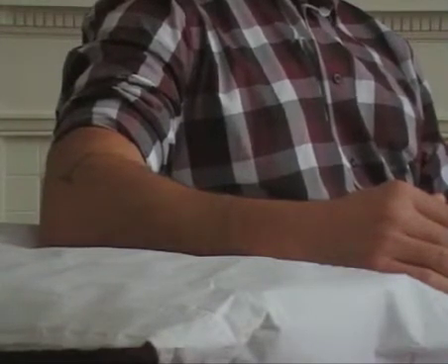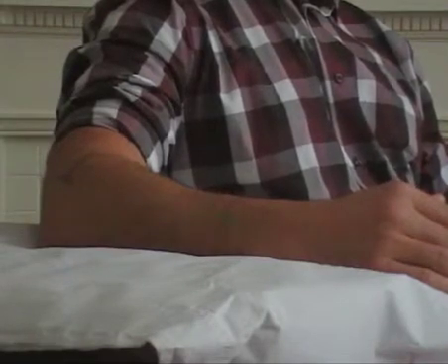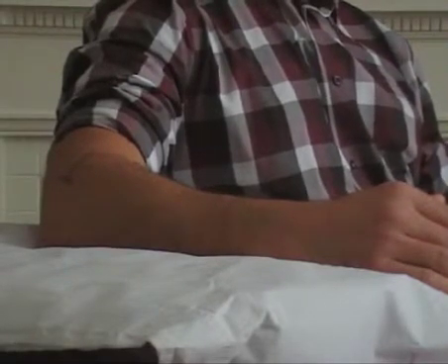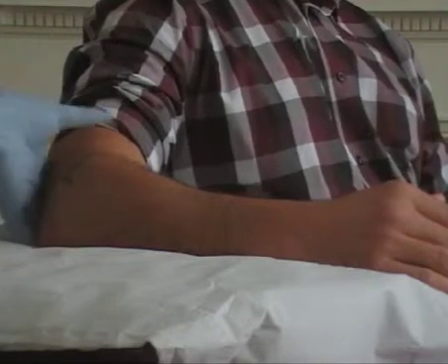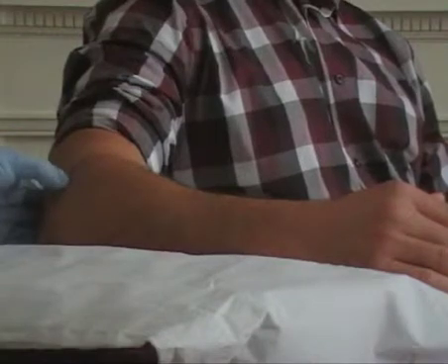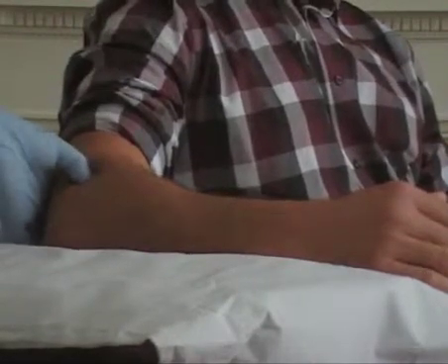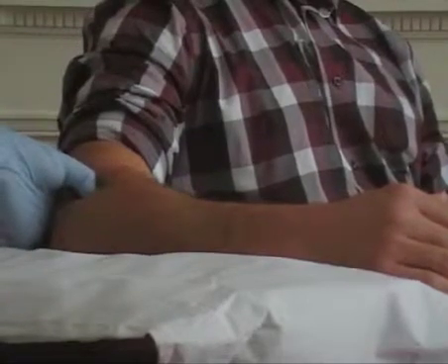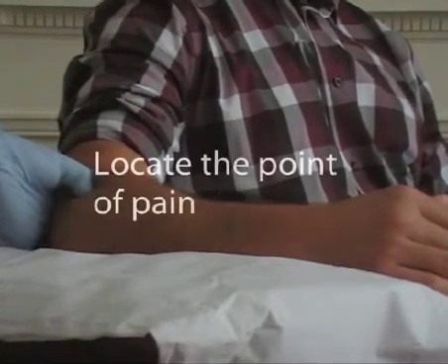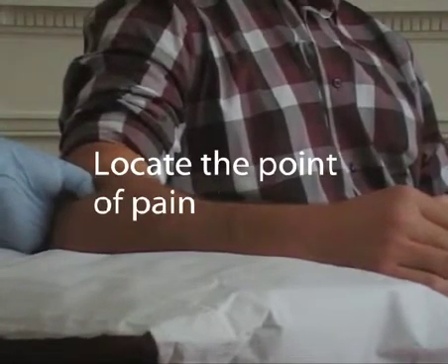The first thing we need to do is locate the common extensor origin. This is the main point that most patients with tennis elbow feel pain. You find the lateral elbow crease, take your thumb down and then go onto the lateral epicondyle, and rock your thumb over and onto the anterior facet of the lateral epicondyle. This is where your patient will probably tell you they feel significant pain.